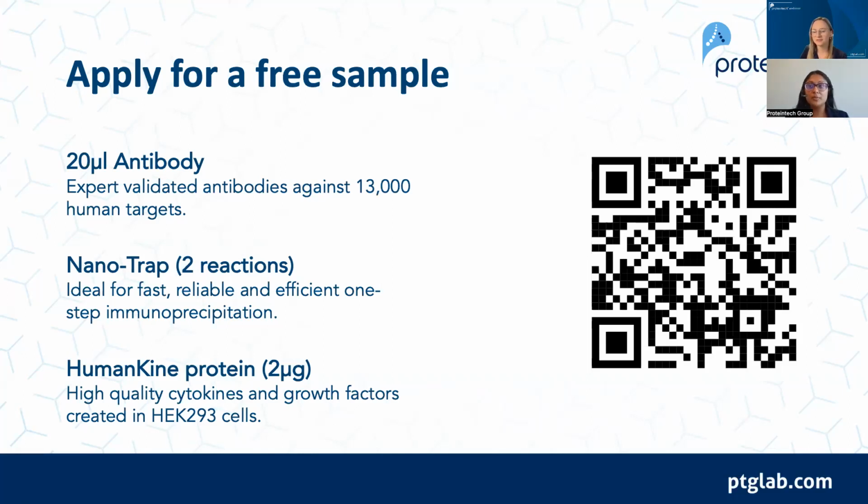No, those would be my suggestions too. I did have a lot of issues in my experience with samples coming off my slides, which is so disheartening because it takes so long to get everything prepared and do all the sectioning and stuff like that. For me, the best was dipping my own slides in gelatin. I know there are a lot of commercial slides available, but there are also a lot of great protocols out there on how to dip your slides in gelatin, and that's what worked for me. Personally, I found gelatin better than the charged slides as well sometimes.